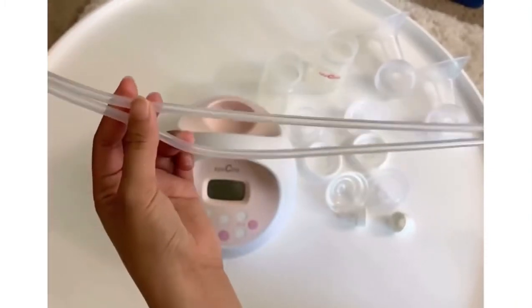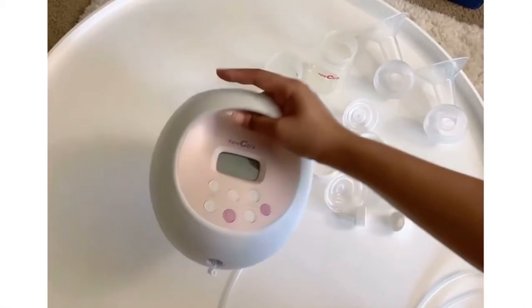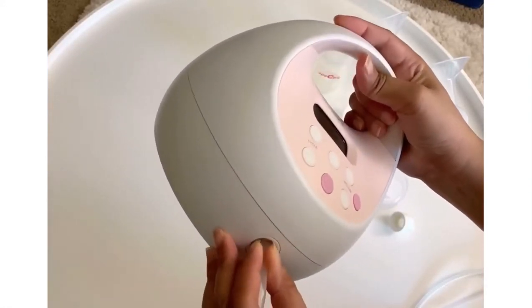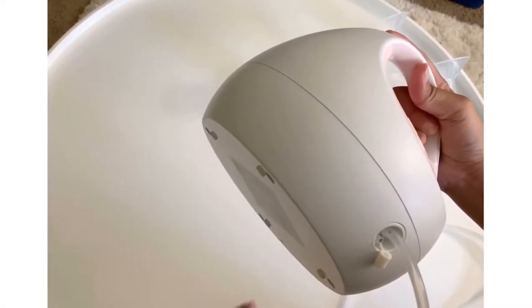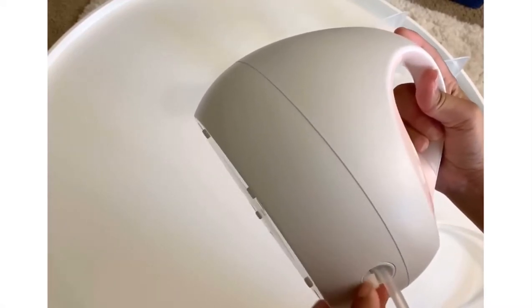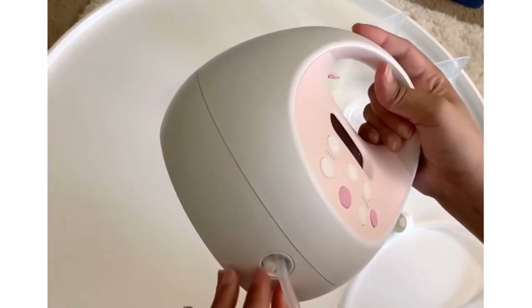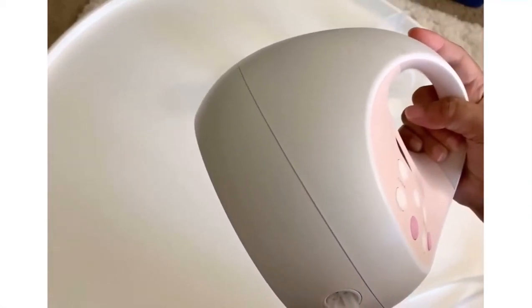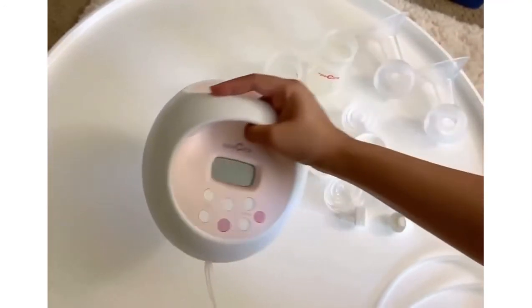The pump comes with two hoses that will be connected to the tubing port of the pump. Connect only one hose if you're only using a single pump. Be sure to close the other tube. And if you are using double pumping, you have to connect the two hoses.